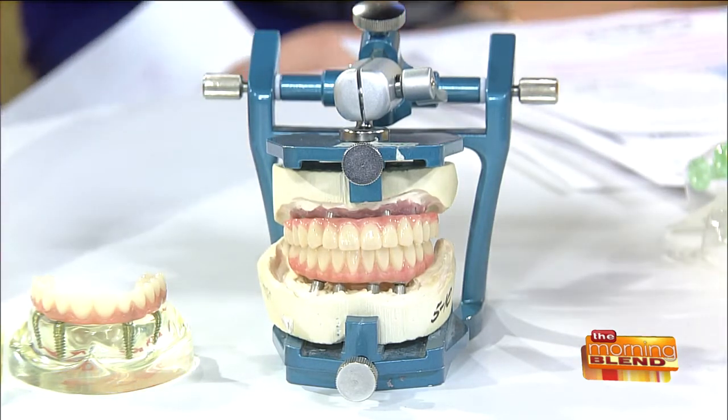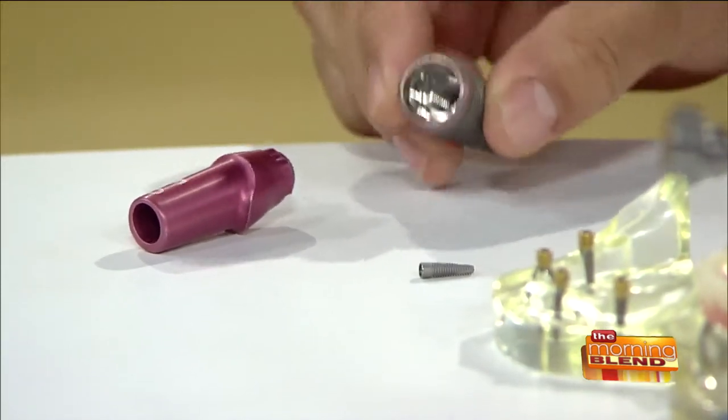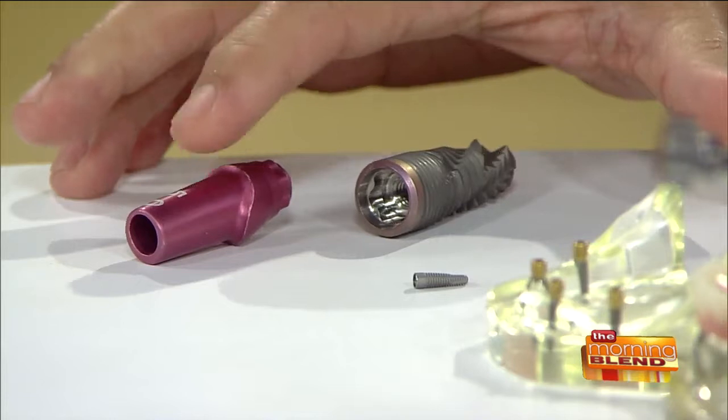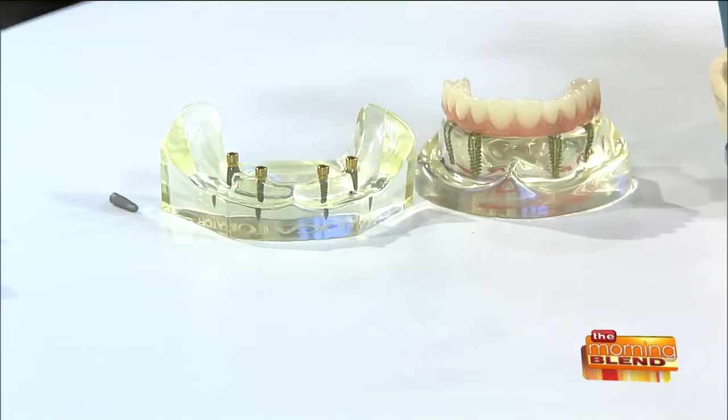So we're looking at this one here. This is basically what we just saw on the screen, where we have the implant itself, and then the abutment that goes over, and then over this we would actually fabricate a crown. So that's just an enlarged version. Yeah, just an enlarged version. Because last time we did it, I had people come saying, "Are they really that size? That big?" No. So we actually brought one here. That's just to demonstrate visually. It's a very small implant. And they work great.